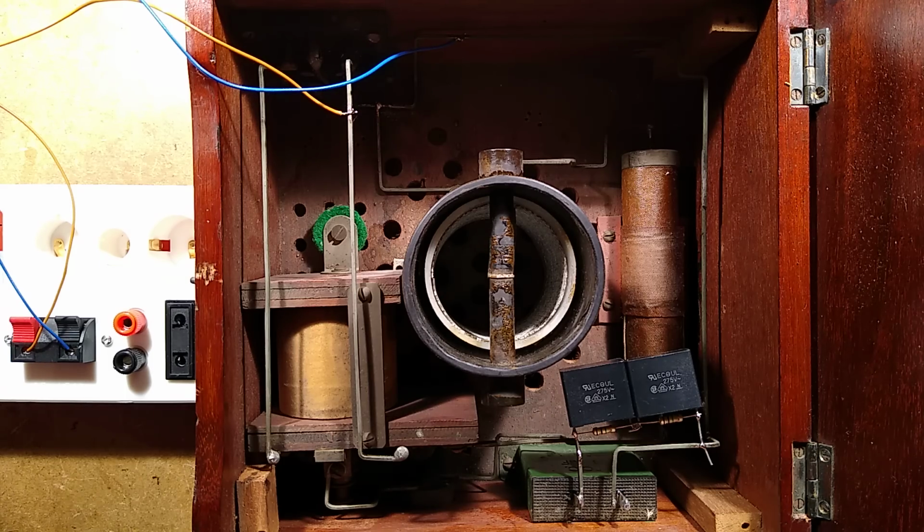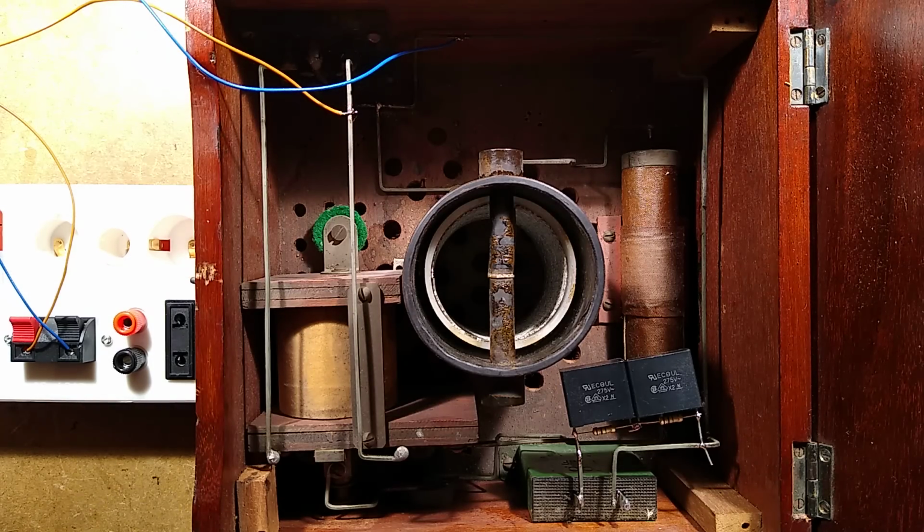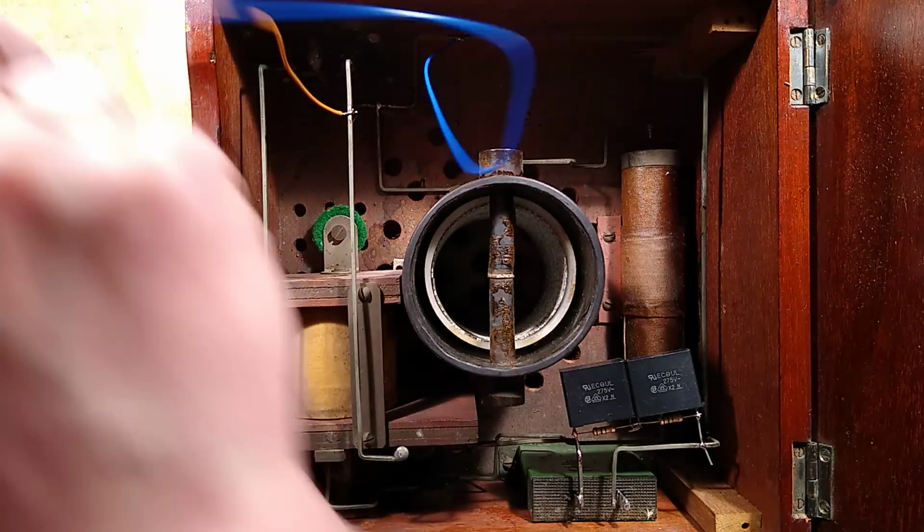Okay. Right, I'm turning it off. 5 watts. Oh, this is stinking of ozone. Oh, it's absolutely honking of ozone. It works. Right, I shall disconnect these.